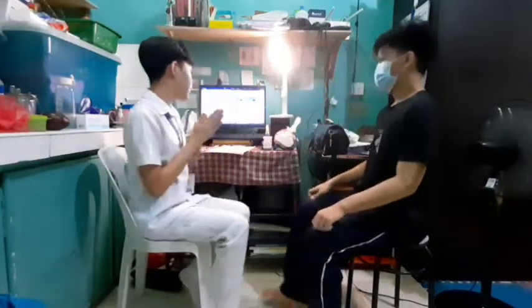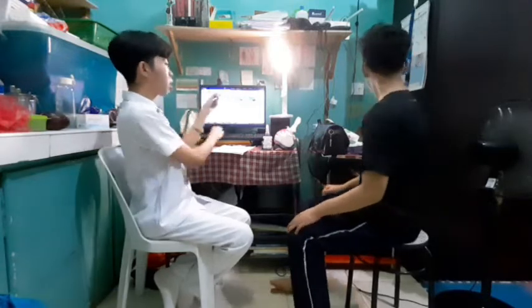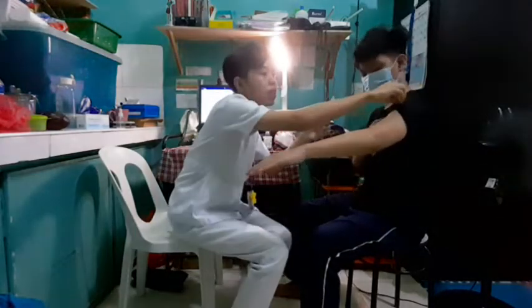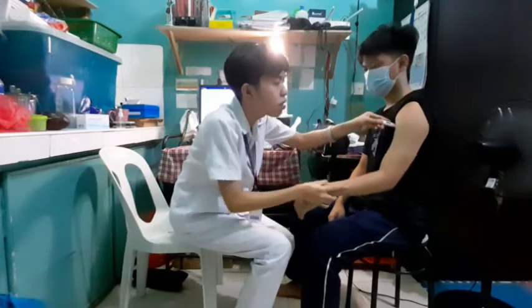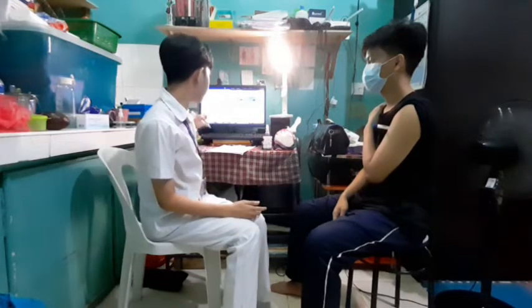I'll take out the thermometer — I have cleaned and sanitized it. I'll ask you to lift one of your hands. I'll remove the clothing slightly and click the thermometer on. I'll be placing it under the underarms. I'll ask the patient to lay the hand across the chest to ensure the thermometer is not being removed. According to the manufacturer's note, we will wait a few minutes or seconds to hear the beeping sound. Waiting ensures accurate findings in taking the temperature.